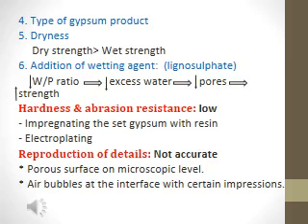The manufacturer adds lignosulfate as a wetting agent inside the powder. So when you use the powder, there is no need to increase the amount of water. We can use less water, so there is less excess water in the final product and less porosity, resulting in improving the strength of the model.